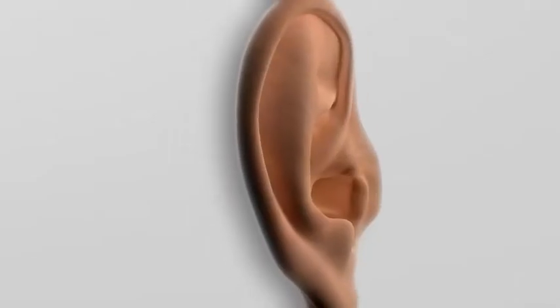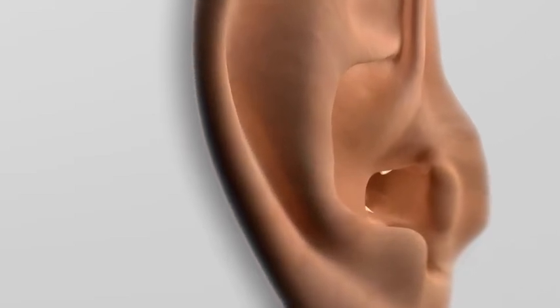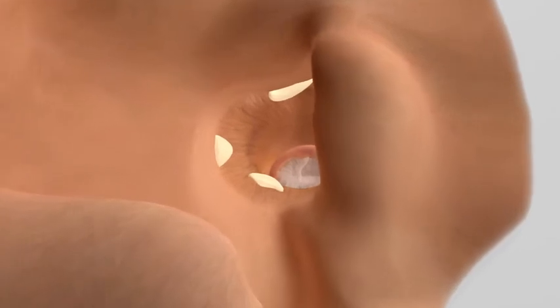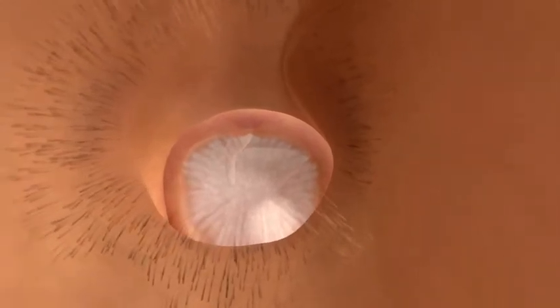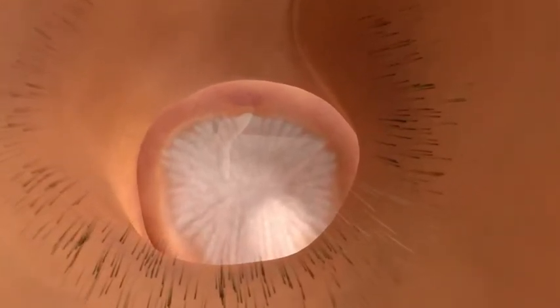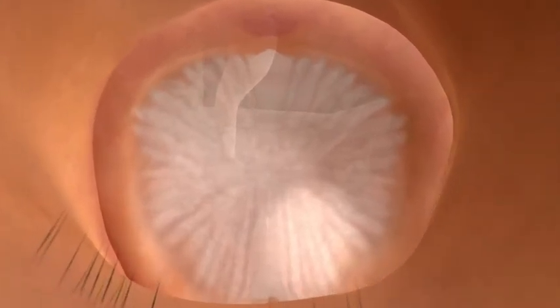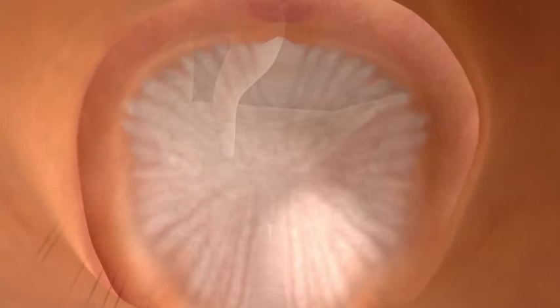For a Lyric fitting, the ear canal must be clean and healthy. All cerumen must be removed, and possible contraindications must be ruled out prior to the sizing and fitting process. Diligent otoscopy is critical for proper visualization of the canal. Once the canal is clean and there are no contraindications, sizing of the ears can begin.